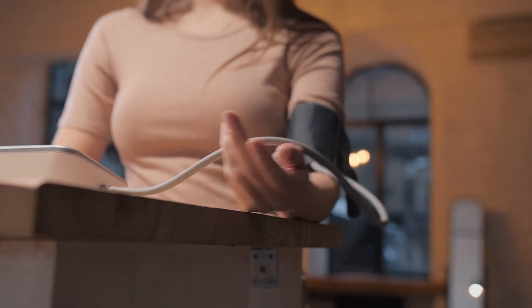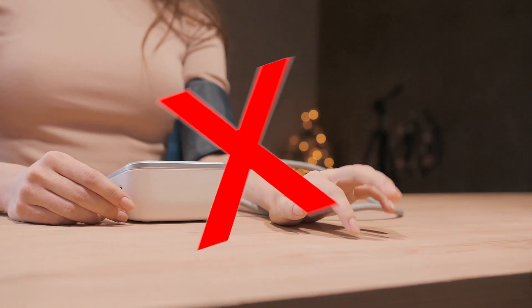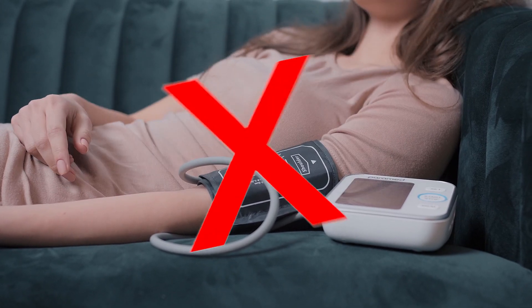3. Do not remove your arm from the table or put it down. 4. Do not move your arm. 5. Do not measure your blood pressure while lying down.